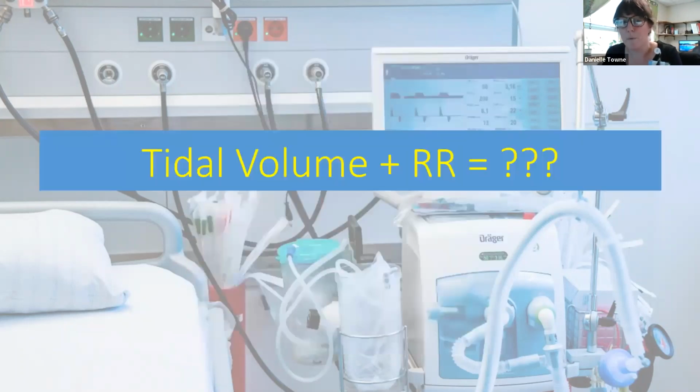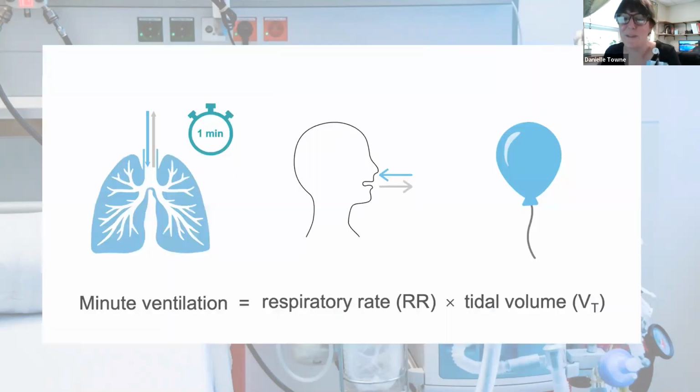All right, so what happens when we add tidal volume and our respiratory rate? What do those mean, right? Well, we don't actually want to add, we want to multiply. So minute ventilation is the tidal volume in mLs times your breathing rate per minute. That total is the amount of air moved in or out of the lungs in every minute. Normal minute ventilation is about 5 to 8 liters, but in your really sick and acidotic patients, you can need up to 15 to 20 liters per minute.